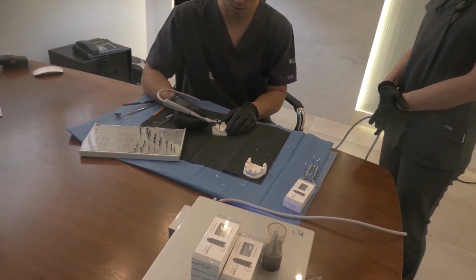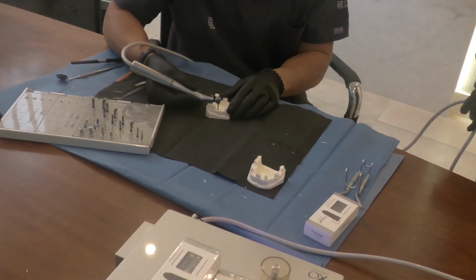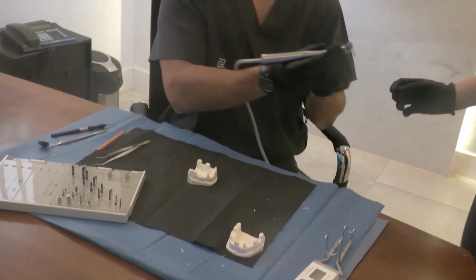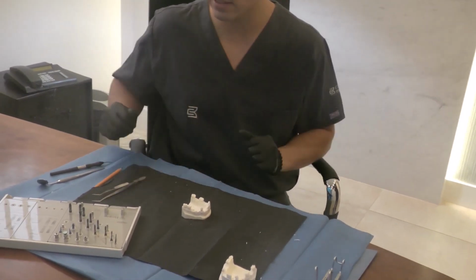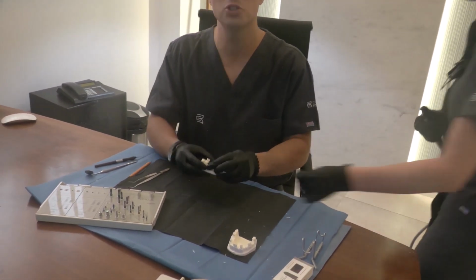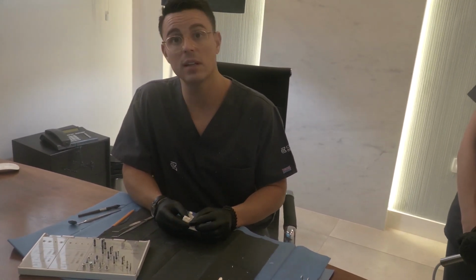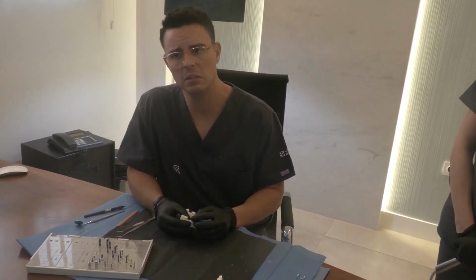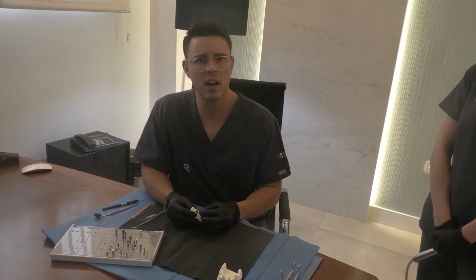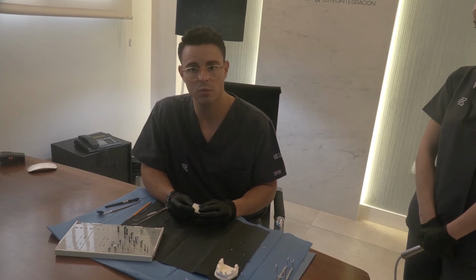Okay, and now that this passive insertion in the coronal area has been achieved, now it's time to place our Inhex dental implant. Again, it will be slightly submerged at about 1 millimeter subcrestally, and will be placed at about 25 to 40 revolutions per minute, never exceeding 50 revolutions per minute.